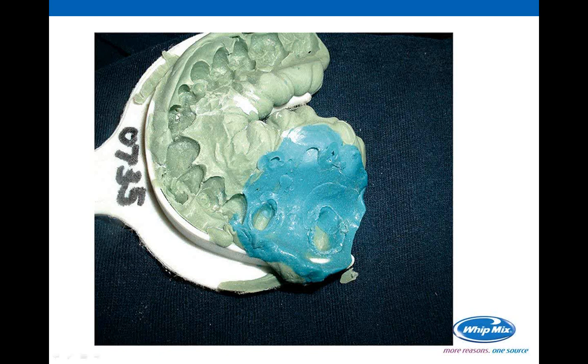All right, well, first of all, remember that granular looking kind of material that was all over the place? It's sort of in there as it is. You can see here, we've got this bit that's sticking up and that bit that's going down, and sort of a wash and all these ridges that are going on. This material was not put together in a timely fashion, and that's why we've got all of that going on.